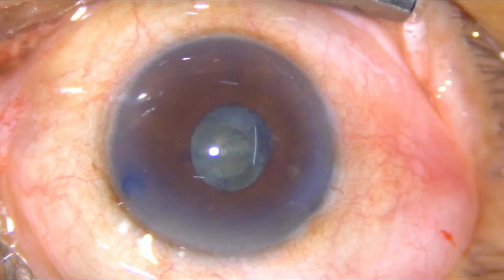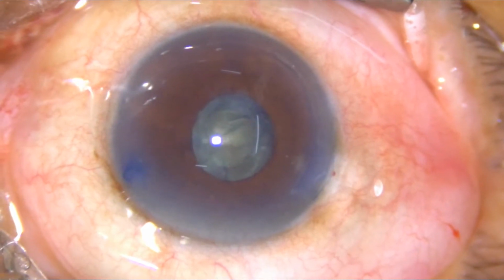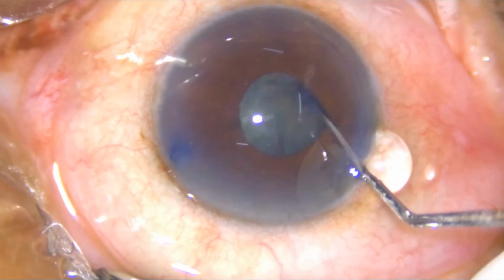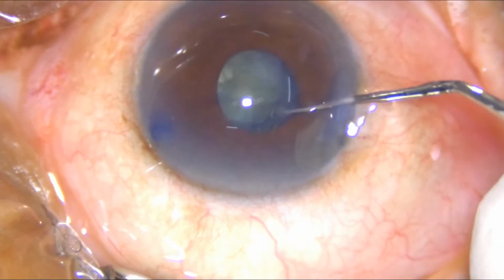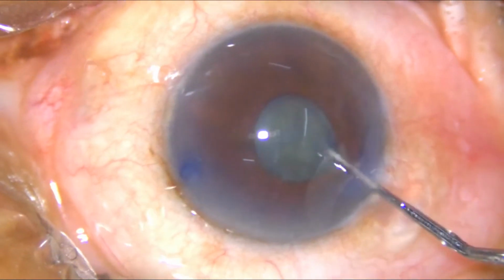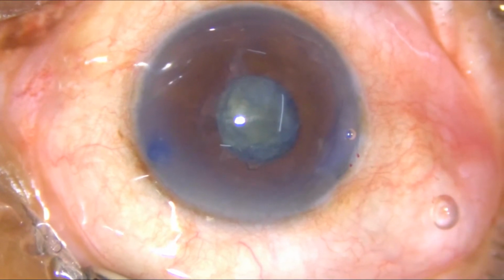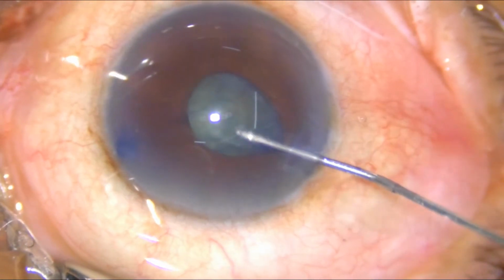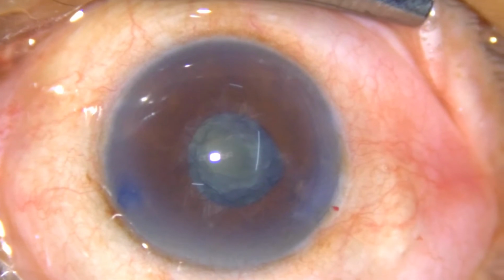Preferably use a high density viscoelastic for these types of cases, and I recommend using particular types of viscoelastic made for that purpose, because they increase your safety and comfort. Do not overfill the anterior chamber with viscoelastic material.